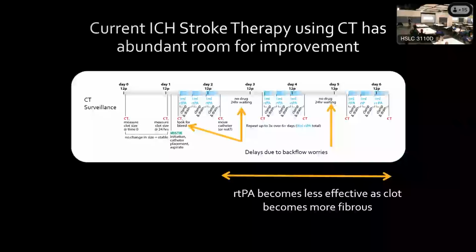To see, your options as a neurosurgeon were to move the catheter back. So you don't normally start at the deepest part of the brain. Then as you move back, you could then decide to treat different spatial regions of the clot.